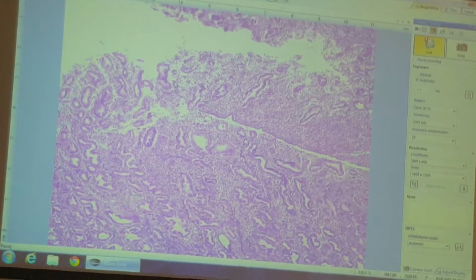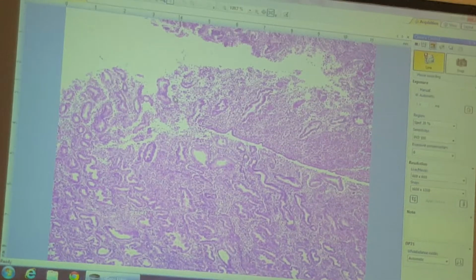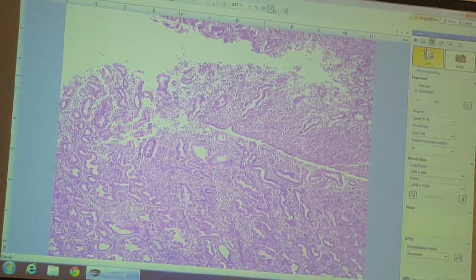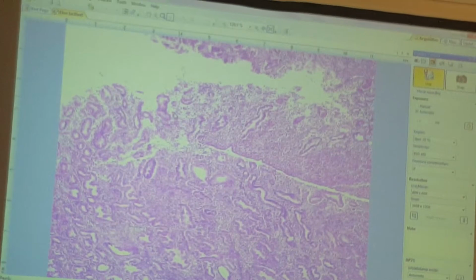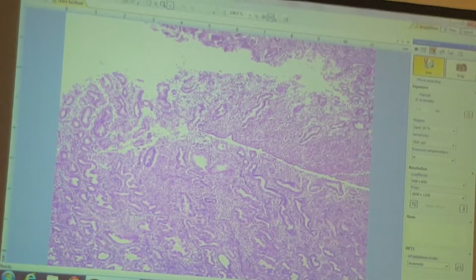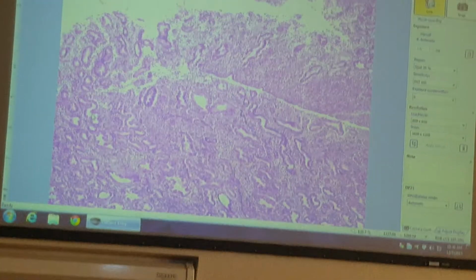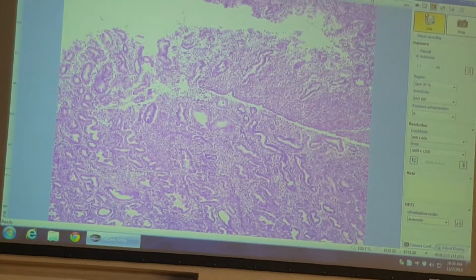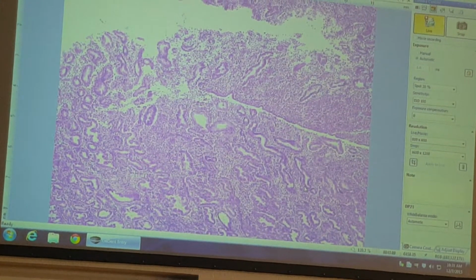So if I had a slide like this on a test and I said, name the organ, it would not be enough to just say uterus. This is uterus in the menstrual phase. This right here is a uterine gland. Again, as long as I see uterine glands in this layer, I know that this is the endometrium.